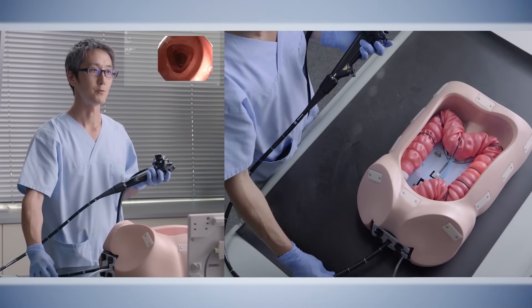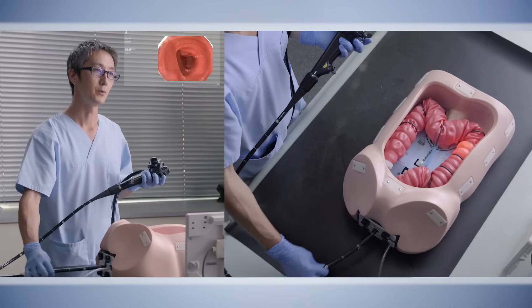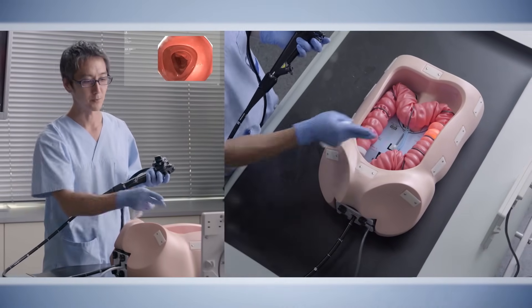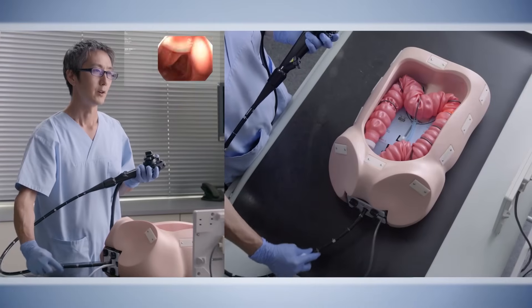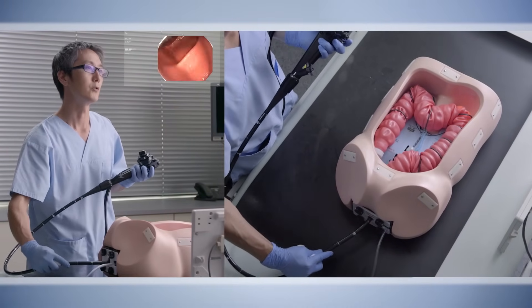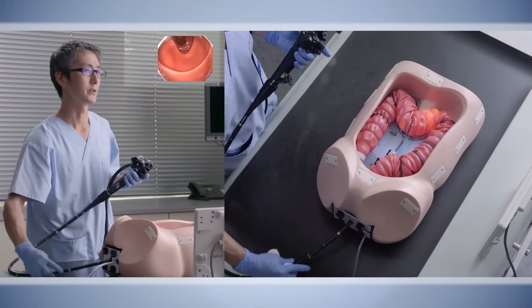You always confirm that you are in the descending colon by this one-to-one movement, and also by the anatomical features — you are from 30 to 40 centimeters in the descending colon. After you are definitely sure that you are in the descending colon, then you go for the second part of the colonoscopy: the transverse colon shortening.